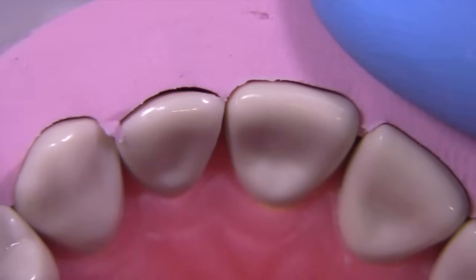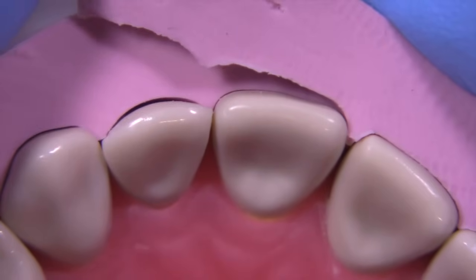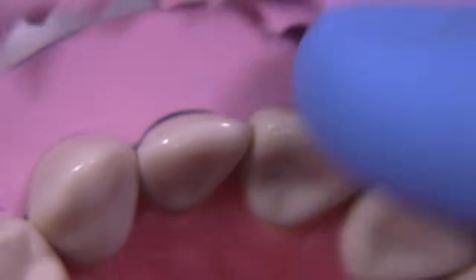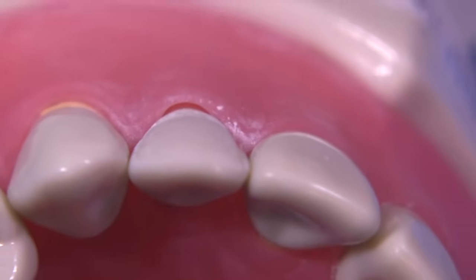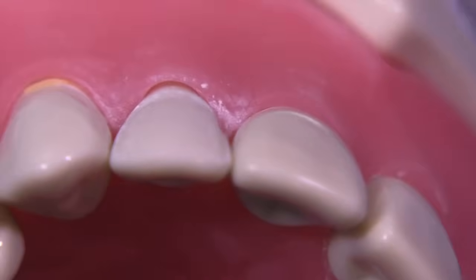We've removed that distal middle section and it's a little bit nicer. Maybe we have a little bit more to go in reduction in that middle third. And on the gingival third, let's tip the tip on back a little bit. You can see that it's pretty good across that area. So the prep guide is an essential feature to reducing the right amount of enamel and not reducing too much.